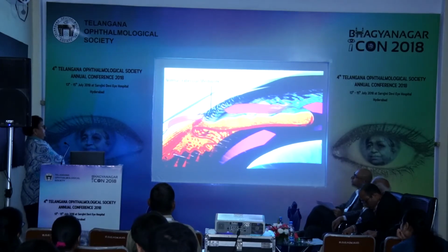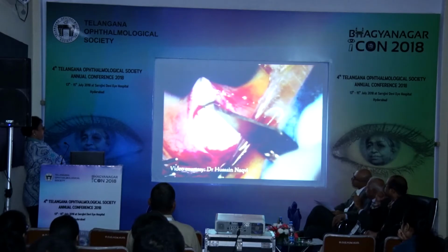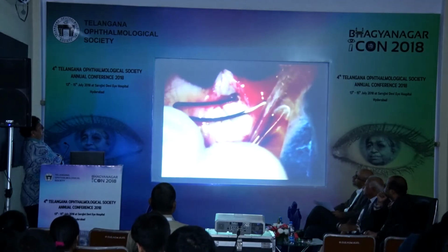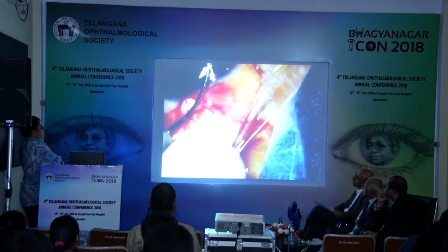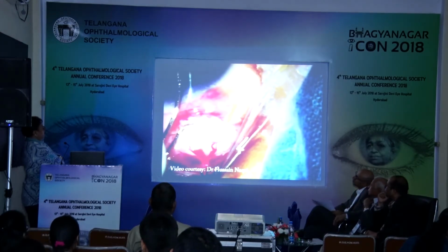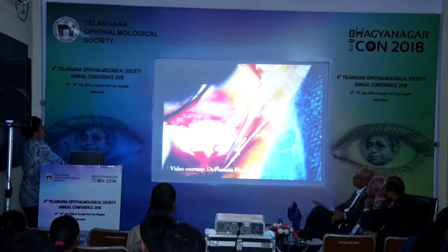Approaching the trabecular meshwork from the outside, or ab externo, has been a surgical strategy used commonly in glaucoma, especially for congenital glaucoma. However, this is fairly major surgery, which entails conjunctival incision and scleral trapdoor, and is often combined with a trabeculectomy.